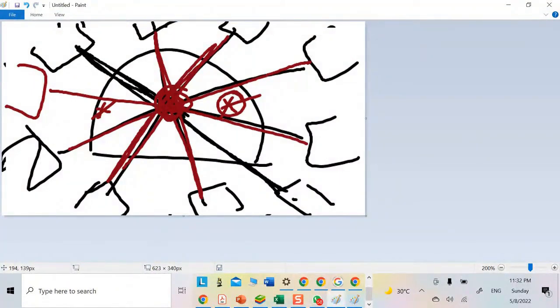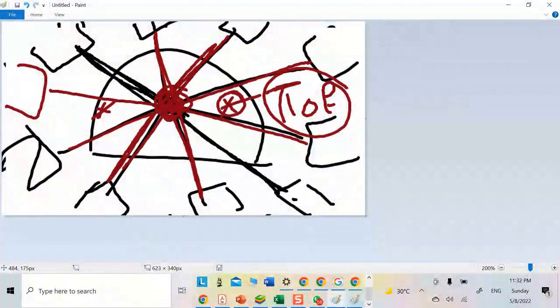So they started to create something called time of flight. What is time of flight? It tells you that there is a machine that has a time of flight option. You know, the distance between this detector and that detector, do you know exactly how much that distance is precisely?